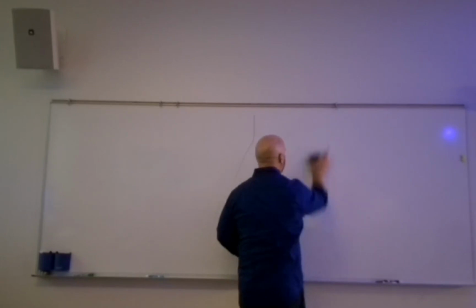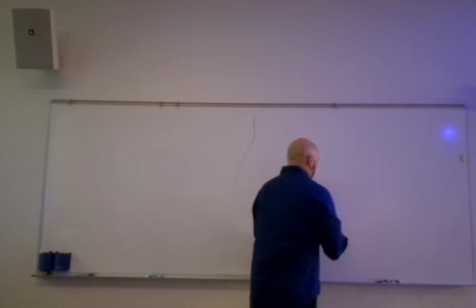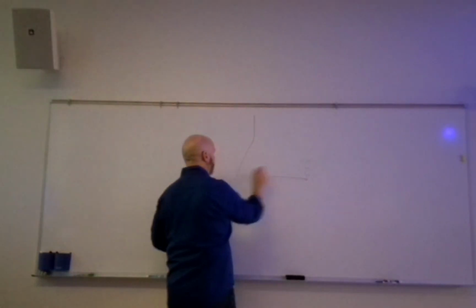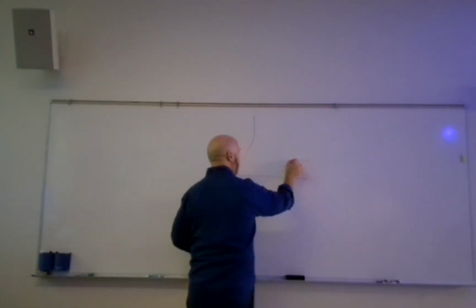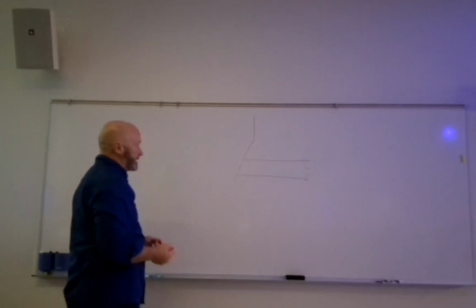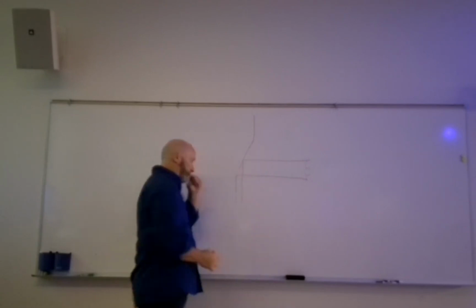So if we use a smaller focal spot, we're going to make it a little bit bigger than what it is there. We use a smaller focal spot, and our electrons are confined to an area. We've got a very good focusing cup, and are confined to that size of an area, then our projected focal spot is going to be this big, right?